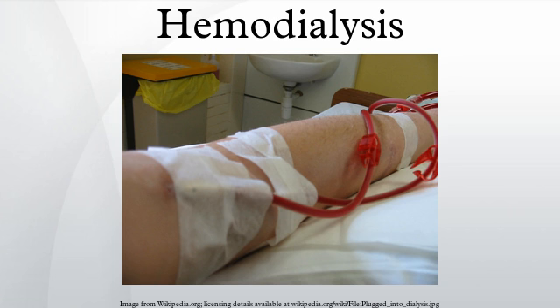The advantages of the AV fistula use are lower infection rates, because no foreign material is involved in their formation, higher blood flow rates, and a lower incidence of thromboses. The complications are fewer than with other access methods.